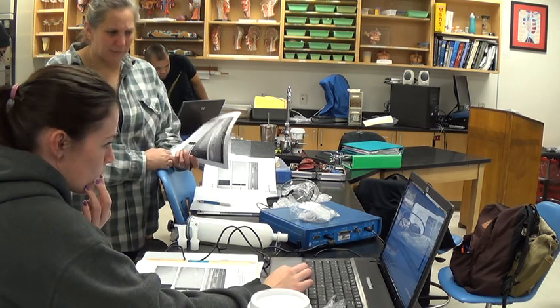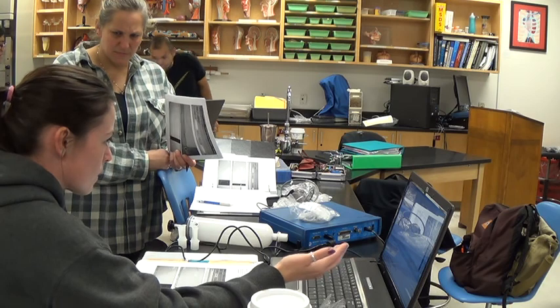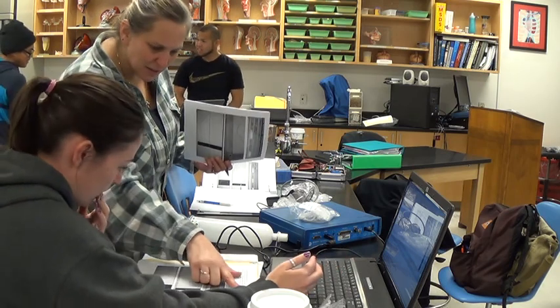Expiratory reserve is what's left in, right? No, where's that on it? I think the thing is it's a second time.